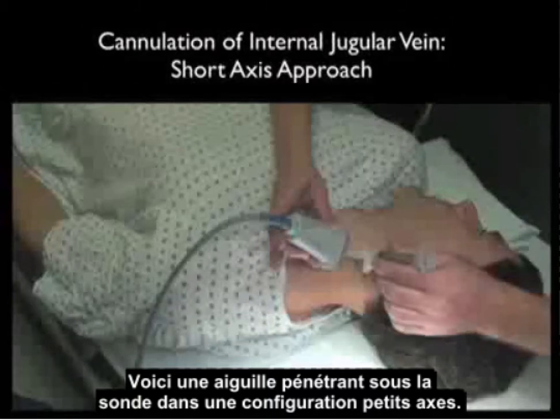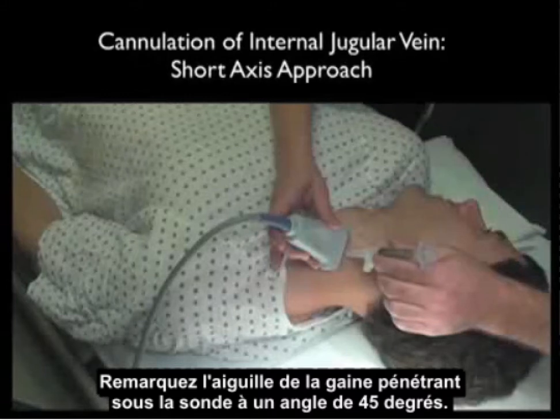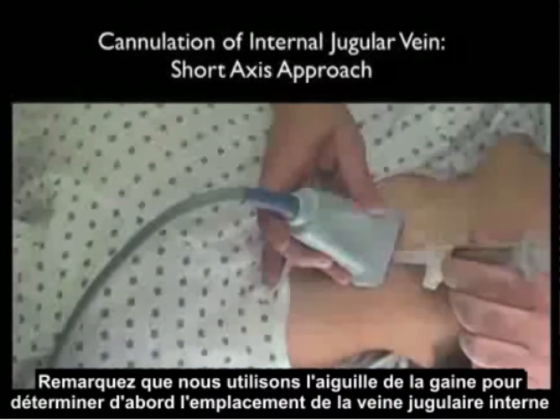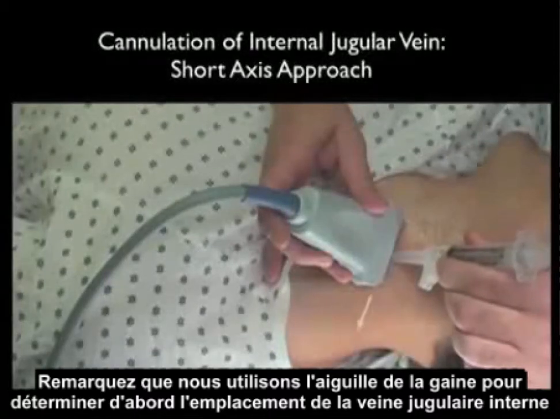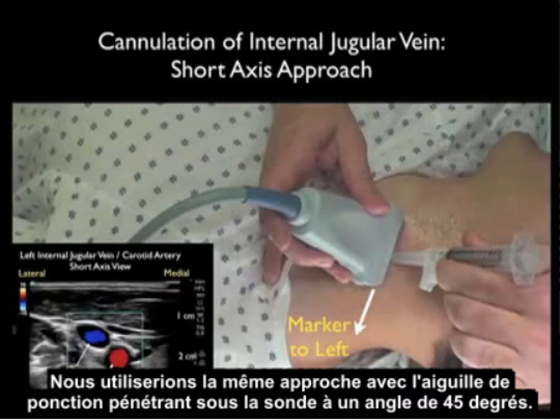Here's a needle coming in underneath the probe in a short axis configuration. Notice that the sheath needle is coming in underneath the probe at a 45 degree angle, and we're using the sheath needle to first determine the location of the internal jugular vein by the ring-down artifact. We would use the same approach for the cannulating needle coming in underneath the probe at a 45 degree angle.